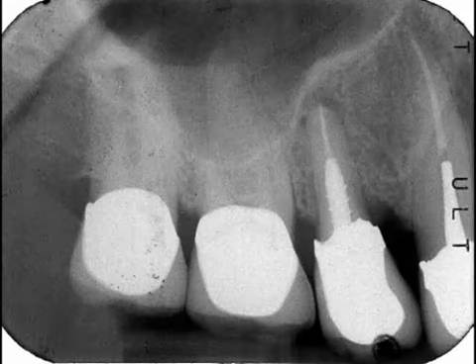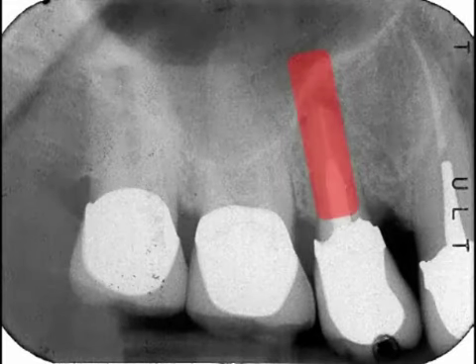Now, a lot of times with a premolar, when you take the tooth out, the socket is the perfect spot in order to place the implant. So you just go right down the socket, prepare the site a little bit, and the implant goes in the same position and same orientation as the bicuspid root. So let's take a look and see if we can do this in this case.